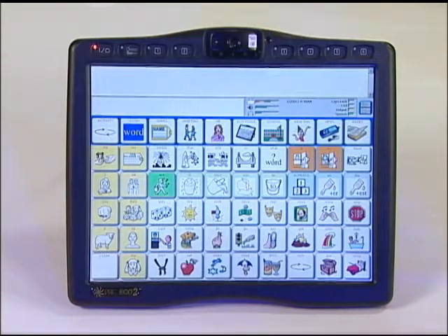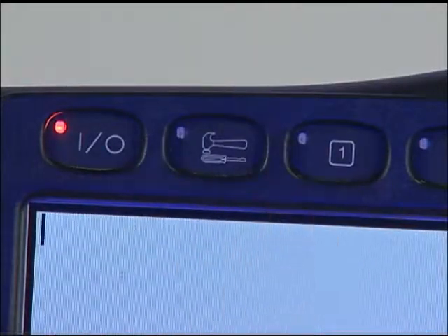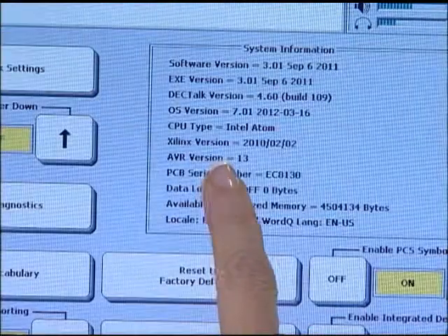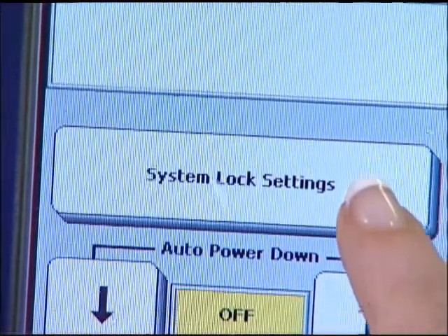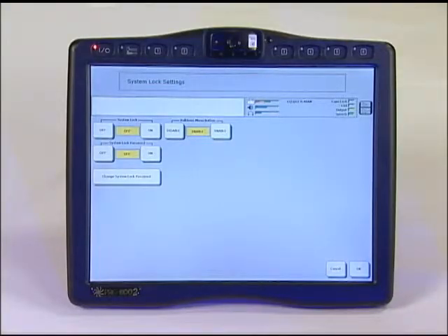To add a password, enter the toolbox and select the maintenance menu. The maintenance menu is a yellow key in the second row. From there, select system lock settings in the top left hand corner of the screen. Then select change system lock password.